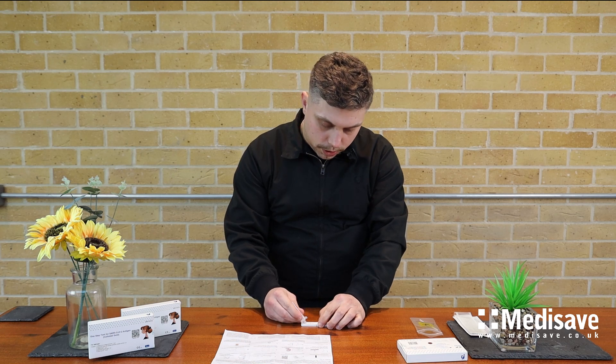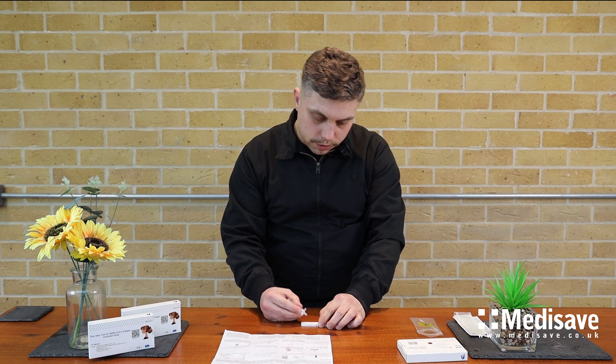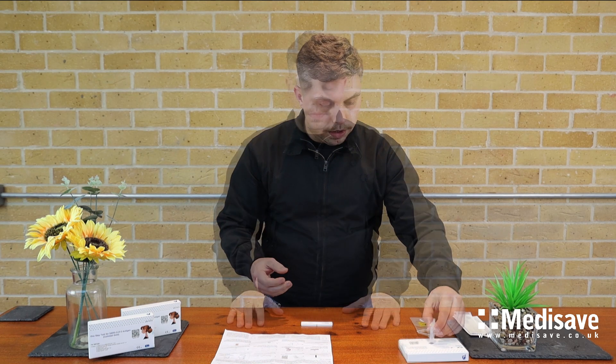Then it's going to be one, two, three drops. That should give us the results within 15 minutes. Anything after that time will be an invalid result.